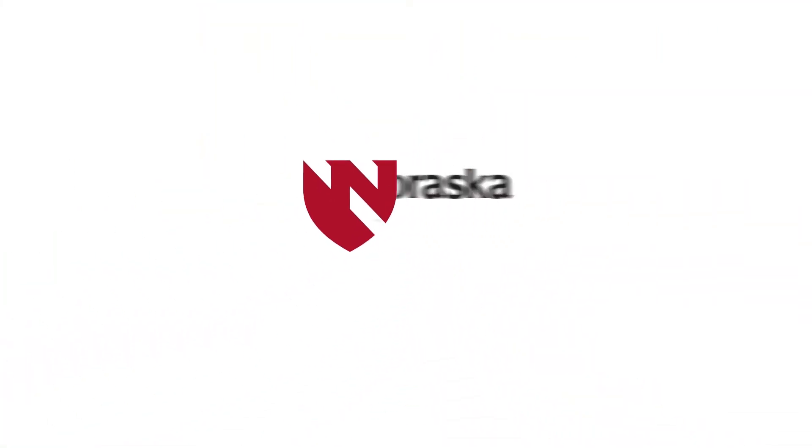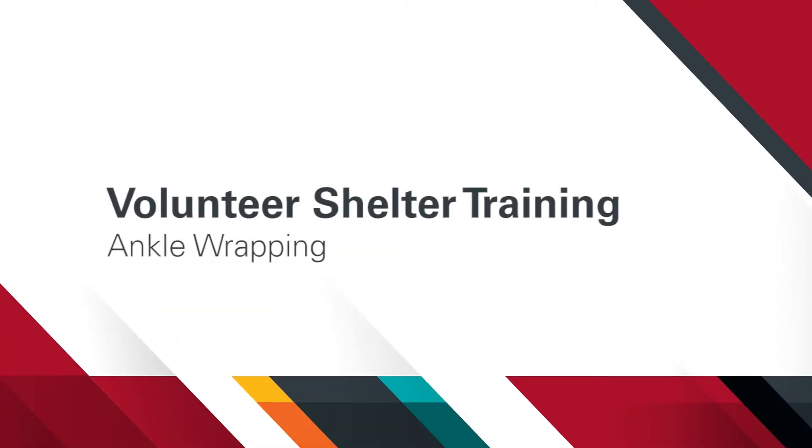In this video, we'll demonstrate how to wrap an ankle for support when there is pain with walking or swelling around the area due to injury. Hello, I'm Devon with the Division of Physical Therapy at the University of Nebraska Medical Center. Welcome to the training series for volunteers in disaster shelters. In this video, we'll demonstrate the proper technique to support an injured ankle with an elastic bandage.